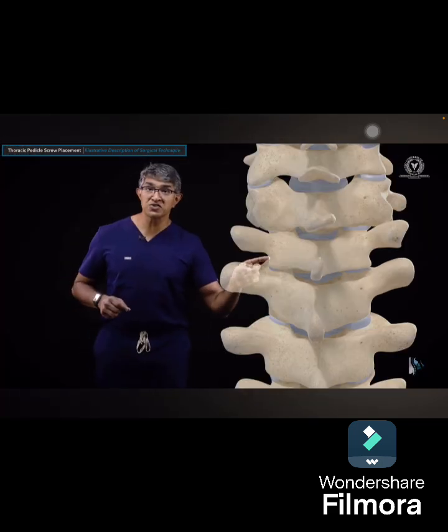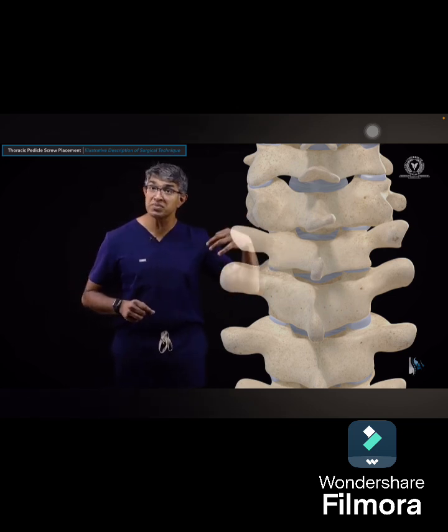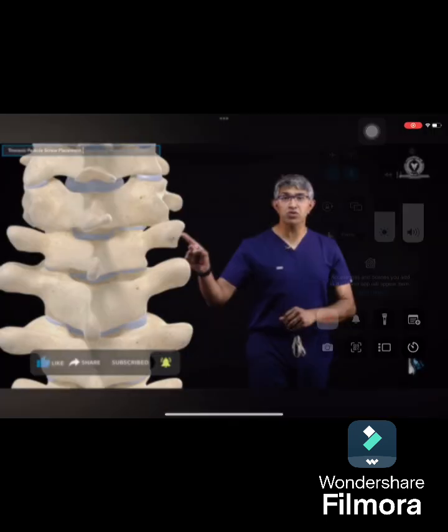I tend to use the pars as an important landmark, the joint is an important landmark, and there's a ridge that you can't see so well on this animation, but you'll be able to see better in a cadaver setting. So these landmarks are the landmarks that are important for placing the thoracic pedicle screw over here. Now if you look at this, there are a couple of landmarks that are important.